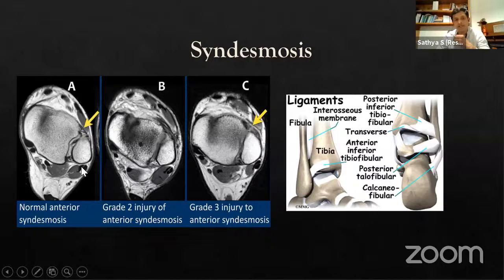The brevis, why am I saying you're able to see the brevis is here? Because the brevis has muscle area. So you're able to see that that's a part of the muscle of the brevis, which continues very low compared to the peroneus longus. So that area is the peroneus longus.